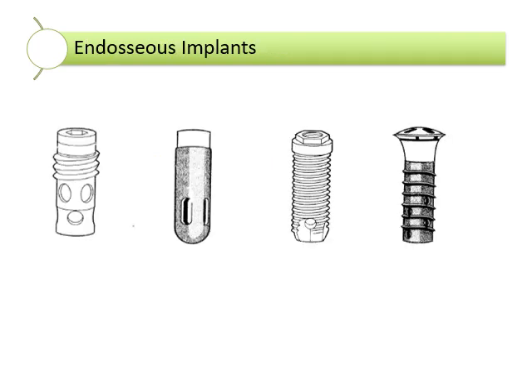The third type of implant that we're going to discuss is the endosseous implant. These are the most common type of implants used on the market today, the ones you'll be seeing with your patients or in your radiographs. These are called fixtures. Your book also refers to them as the body of the implant. You'll hear them used interchangeably, though I believe you'll hear fixture more than body. All four on this page are endosseous implants, no matter what they look like.